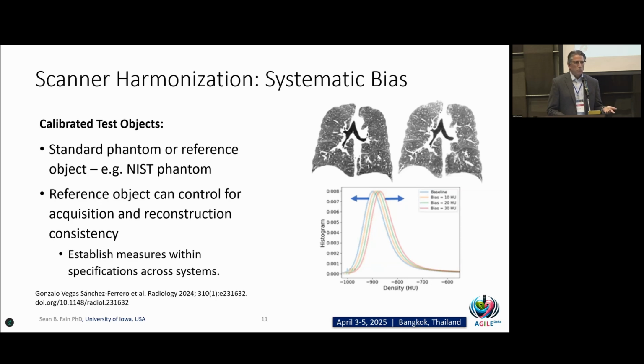This is one of the principal efforts around the Quantitative Imaging Biomarker Alliance and the new QIBA's extension of that organization, which is to develop these standard phantoms or test objects. I'll show you one in a subsequent slide. We have several of these that enable us to look at parenchymal density, and NIST qualified foam standards that have known Hounsfield units at known X-ray energies.